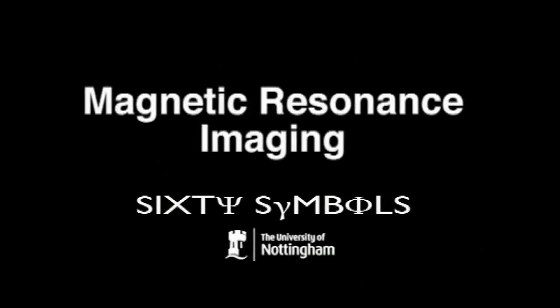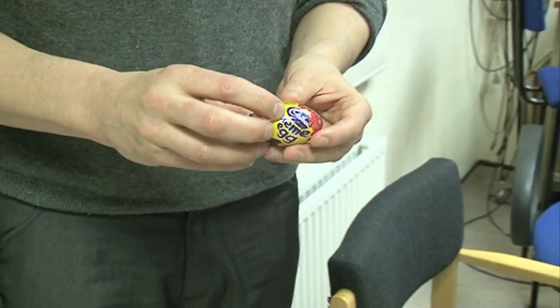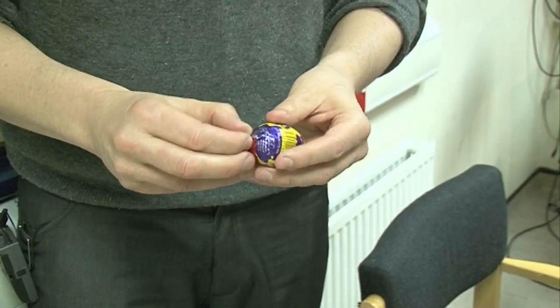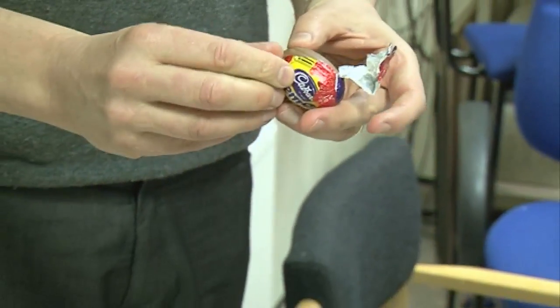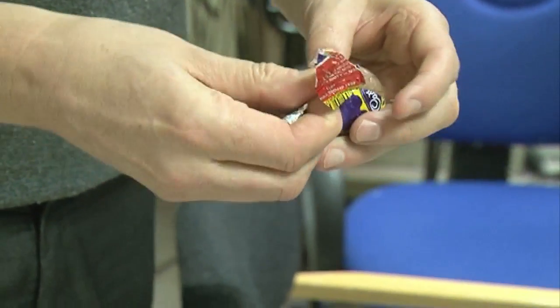In order to get a signal in MRI, we have to use radio waves. The cream egg, inconveniently for MRI, is surrounded by a metallic foil. Radio waves won't pass through this foil. So in an MRI scanner, what we're doing is measuring a signal that comes from hydrogen nuclei.